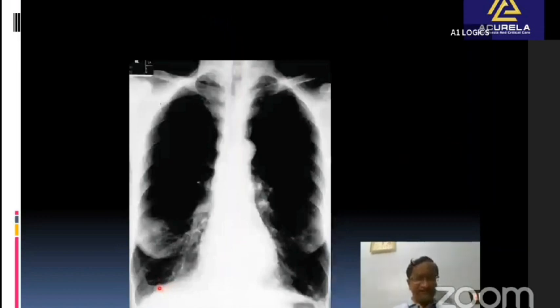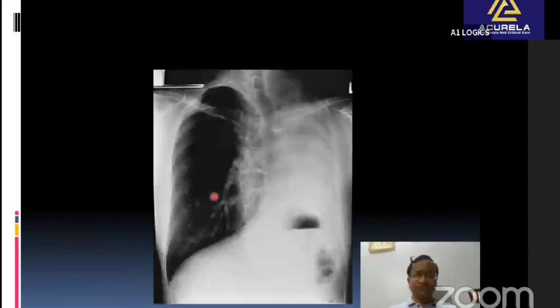Here you can see flat, irregular diaphragm, completely emphysematous lungs. This is like a slightly tubular heart. Now this is likely to be emphysema. Now you can see here a push, you may think that it is a collapse. Here you can see this is also lifted up.